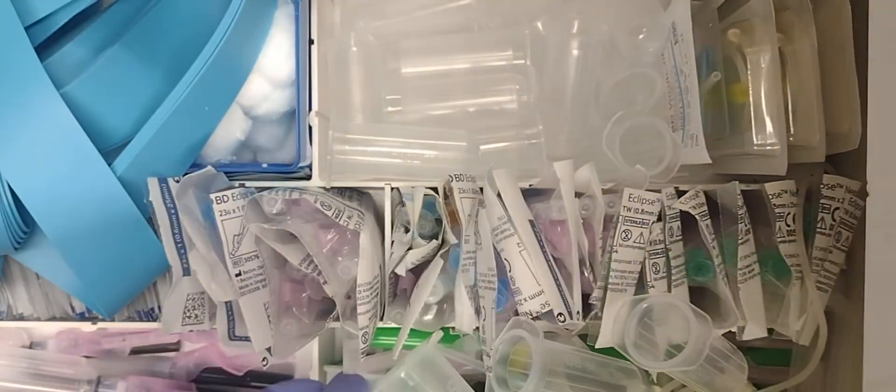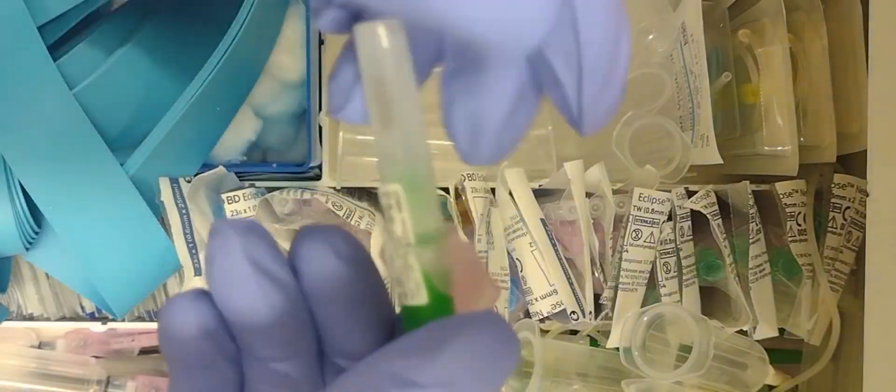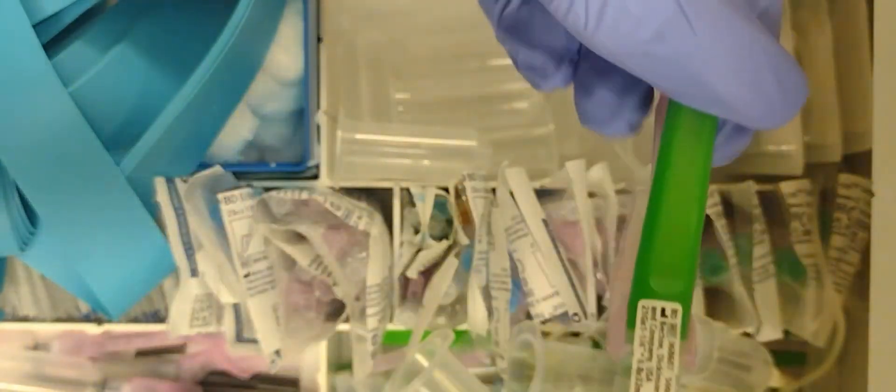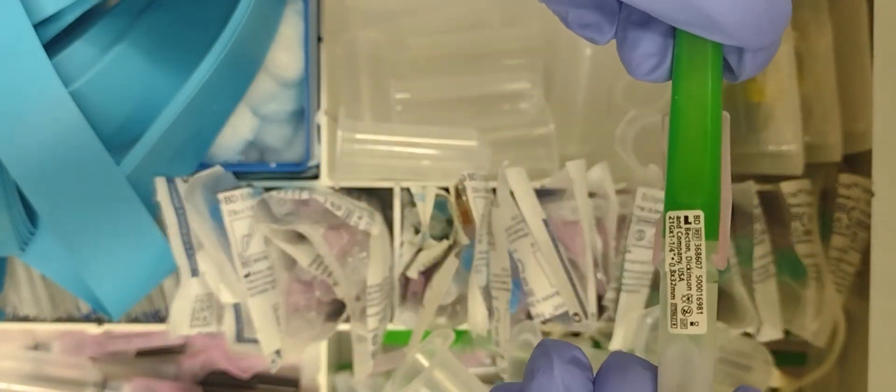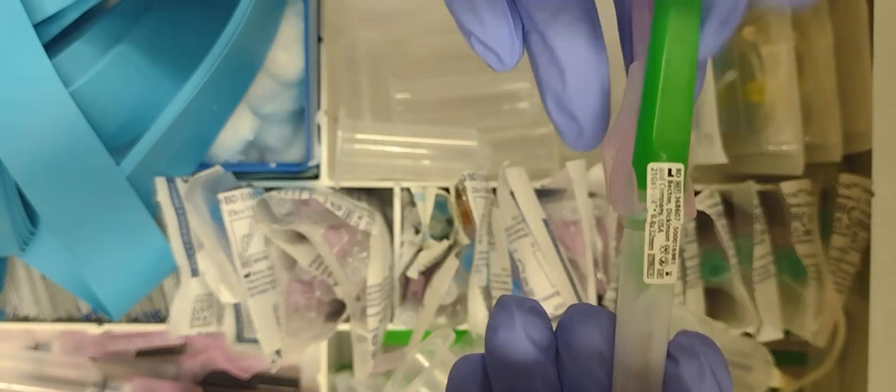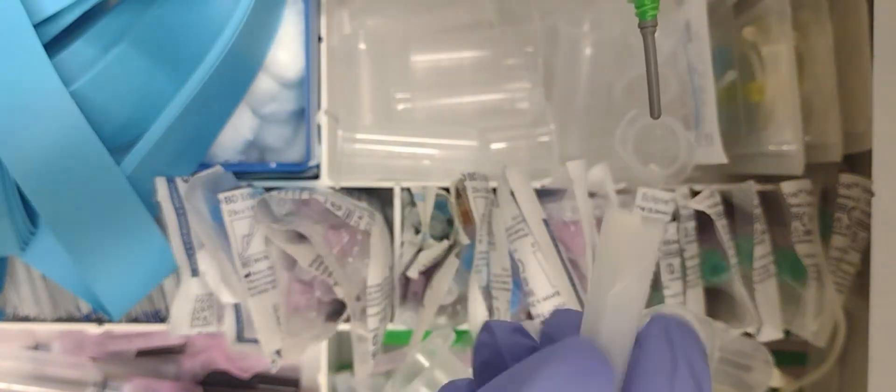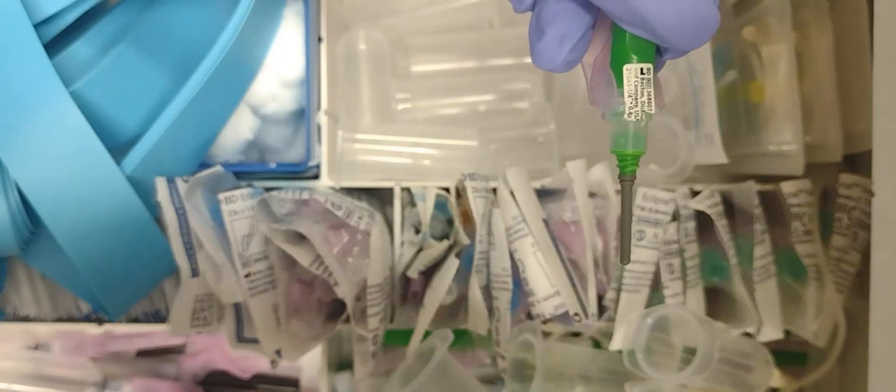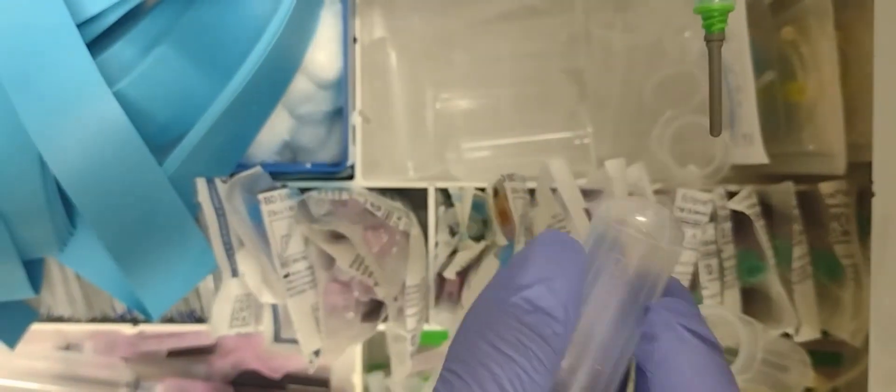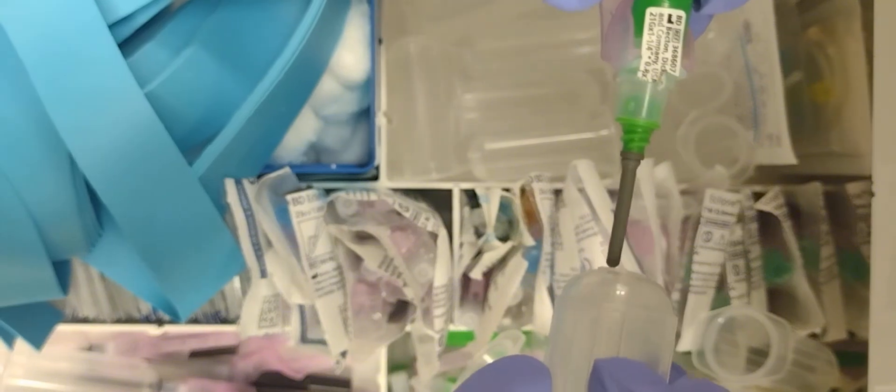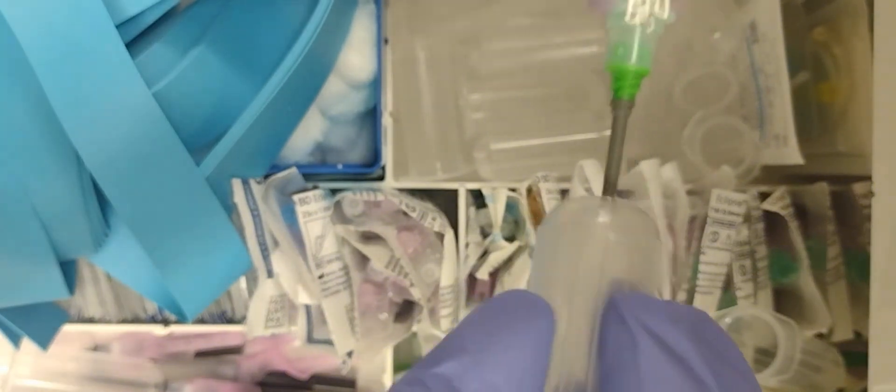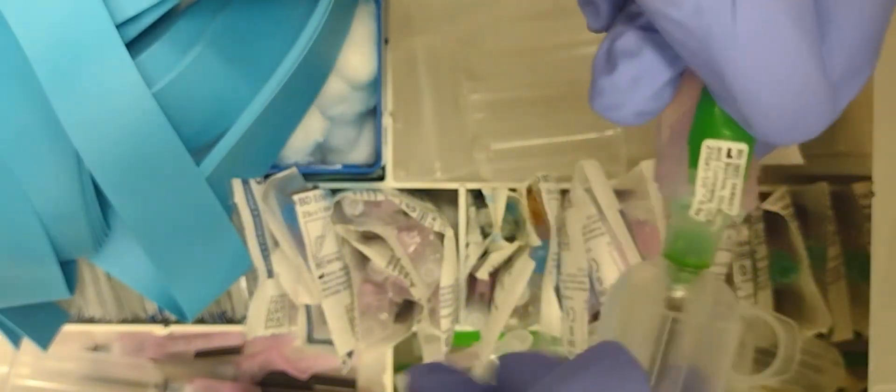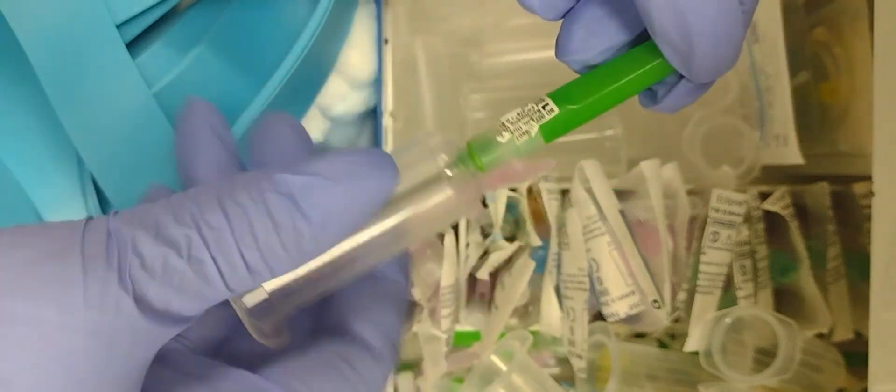So what this is over here is a bigger gauge needle. This is a 21 straight vacutainer needle. You do the same way you do with the 22 vacutainer needle: you twist the hub on. And it's a larger needle.